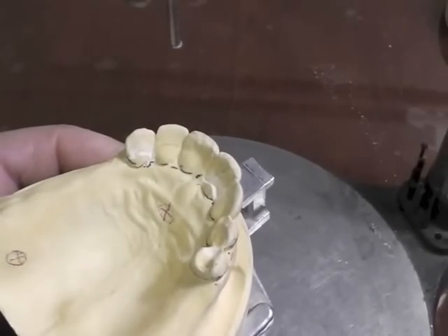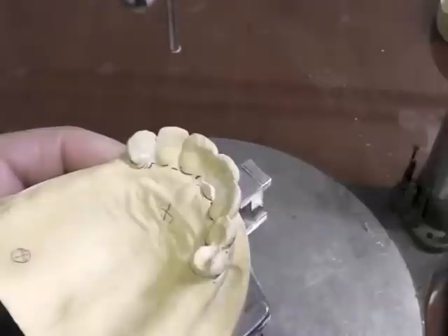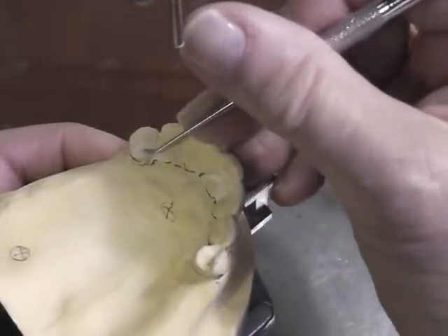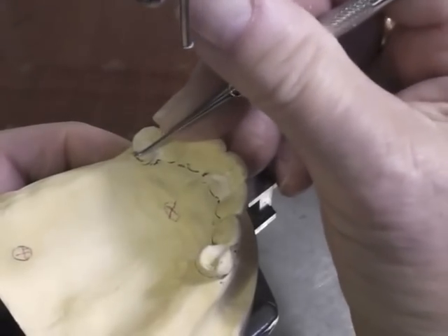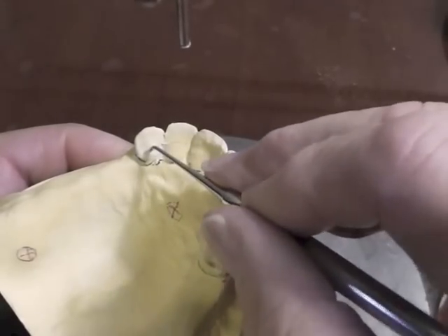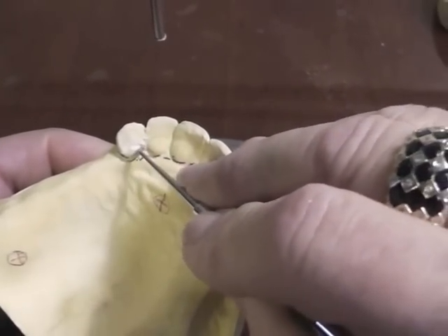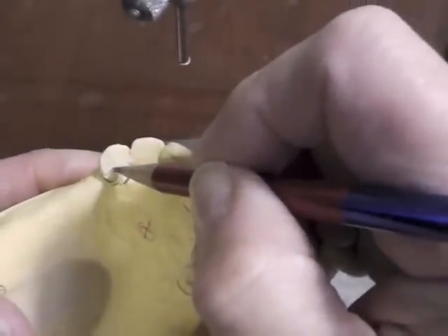The partial denture has to seat straight down and can't get into an undercut along this area, so you have to remove any undercut there. Come up with a positive ledge that looks like a chevron, rounded at the top. I would go ahead and put my rest in red.